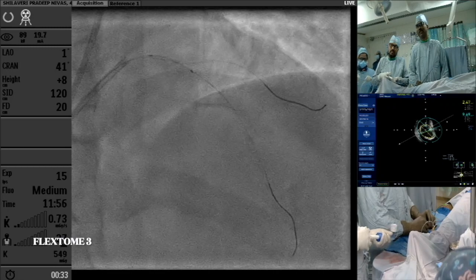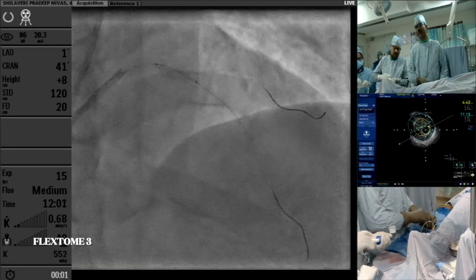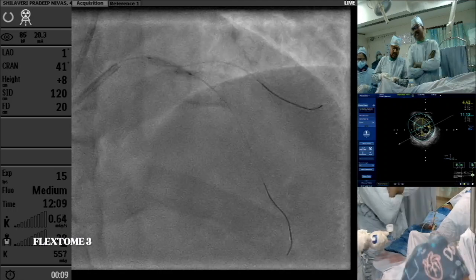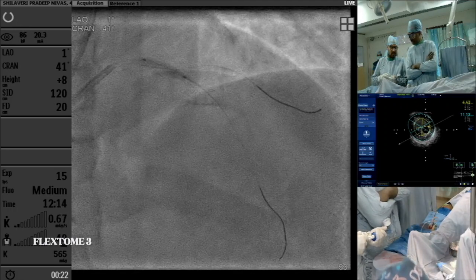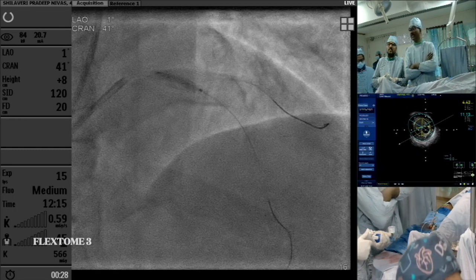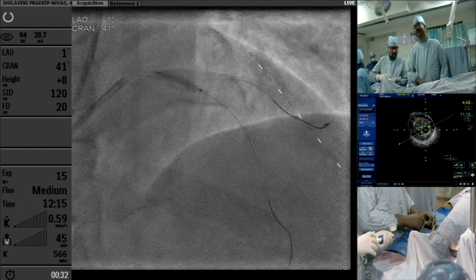Yeah, just dilate. Go to 10. 6. 8. 3 millimeter. 3. Because in that place we don't know the size as well, because it's all calcium. So we are only taking size from the distal reference. So distal reference. Okay. Meanwhile, what is the ostial LAD?